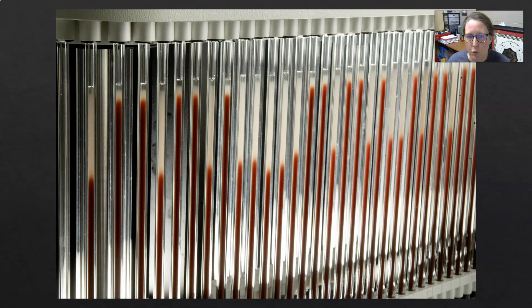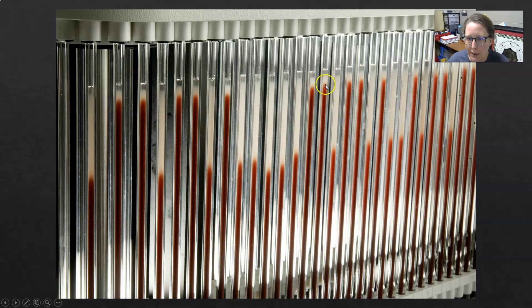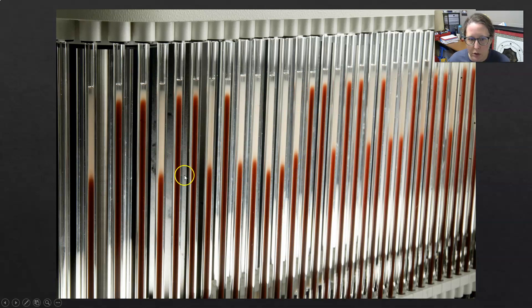This image shows what the SED rates can look like on different samples. A normal SED rate would be like these, where the red cells have barely had time to settle in that one-hour time frame. The elevated samples shown here have more settling of the red cells in the same time frame.